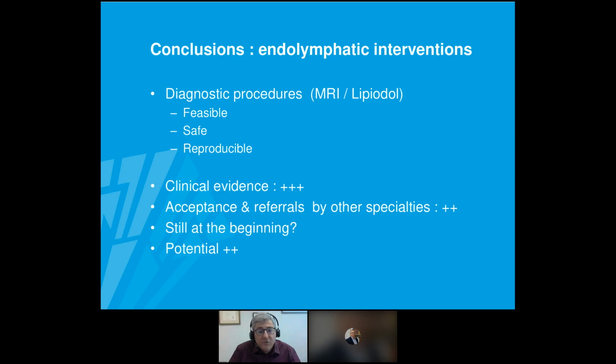The good news is that, of course, you might have some infectious complications or some local damage. For instance, when you go through the pancreas, you might have some mild pancreatitis. However, they've never seen big bleedings or other serious adverse events related to the puncture of the cisterna chyli and the catheterization of the thoracic duct.